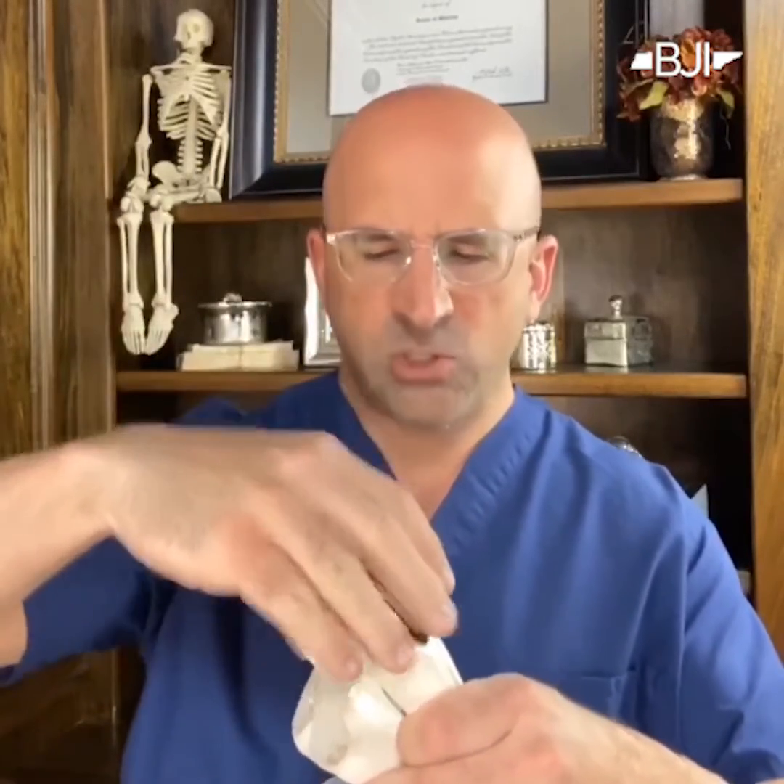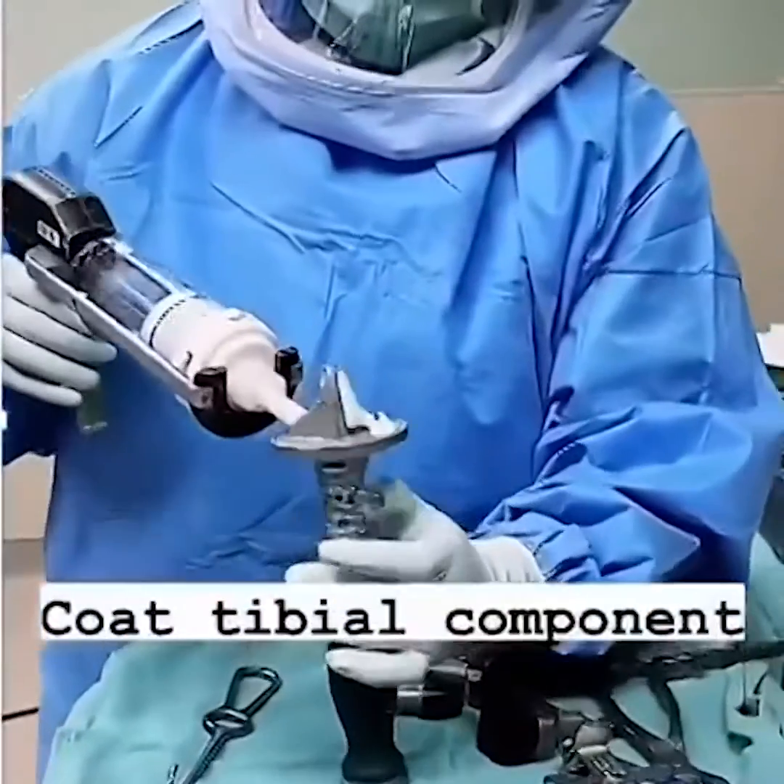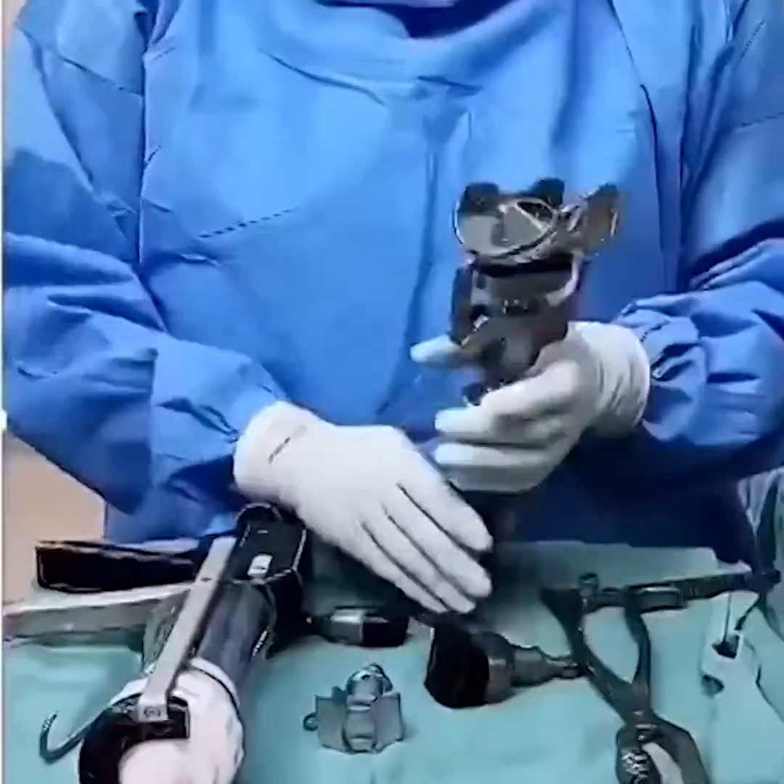And we push them together. By pushing them together and allowing it to hold still for about 10 minutes, that doughy material hardens and bonds the metal piece to the bone.